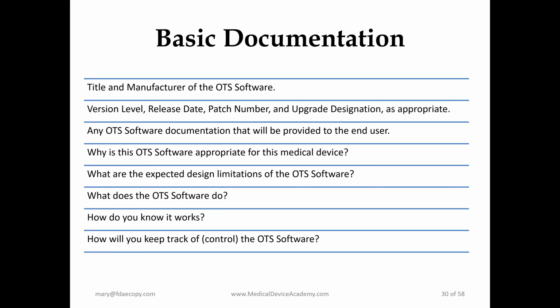And it's important that the FDA mentioned several times in the guidance that it's really important that you mention the specific version level or release date, because they need to see revalidation if you're changing the version level of the off-the-shelf software. Since that is something that's outside of your control, if you're adding their updates, you need to be making sure it's not causing any problems. So they want to see that version level history of your off-the-shelf software within your device. So sometimes that requires a new 510(k). A lot of times it doesn't, but that's why that's an important element to include here.